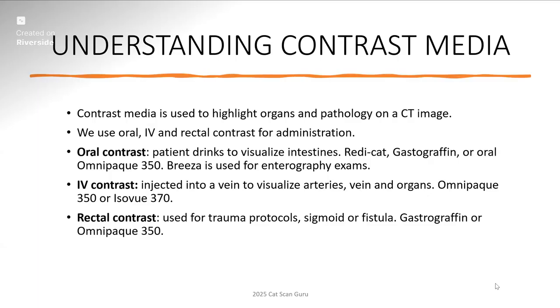Or oral Omnipaque. Now, Omnipaque has been approved by the FDA for oral consumption, so we do use it as IV and oral. Whether it's 300 or 350 really doesn't make a difference. We do use 350 for oral consumption at my facility, and for rectal contrast as well, and for cystograms. I know at another facility prior, we used 350. I know others use 300. It just depends on your protocol.